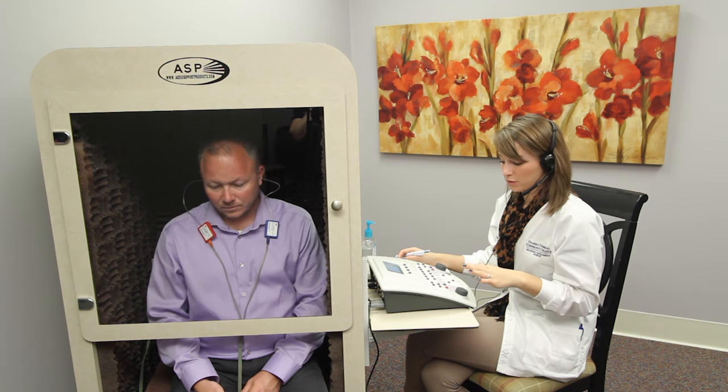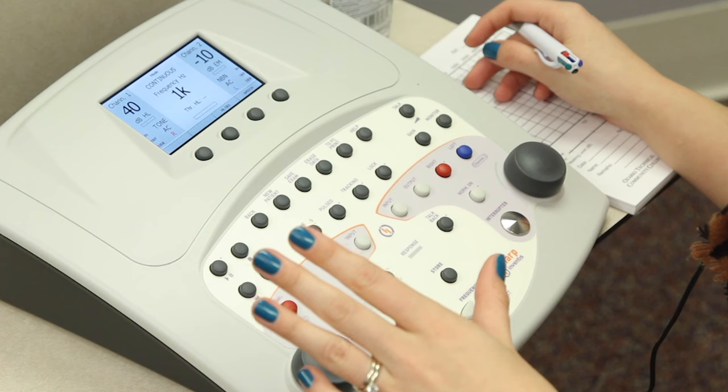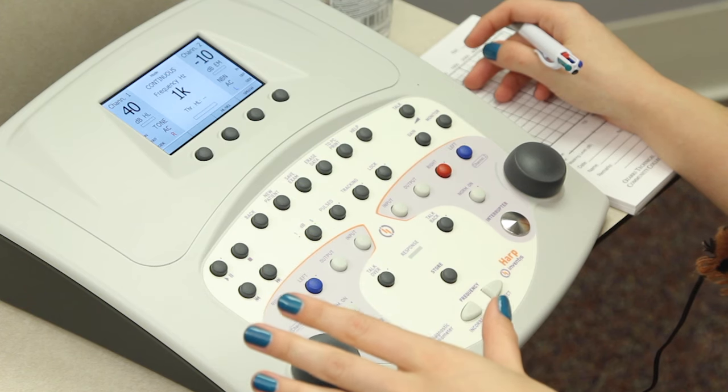I'm starting with 1000 Hz because it is the best frequency for test-retest reliability, and I'm starting at 40 decibels because that is a loud enough tone that is readily heard by most patients. You can always turn it up if your patient doesn't hear when you present, but for now we're just going to start with 40. Once I start presenting my tone, I'm going to use the bracketing method by going down 10 until the patient doesn't respond and then going up by 5 until they do respond.